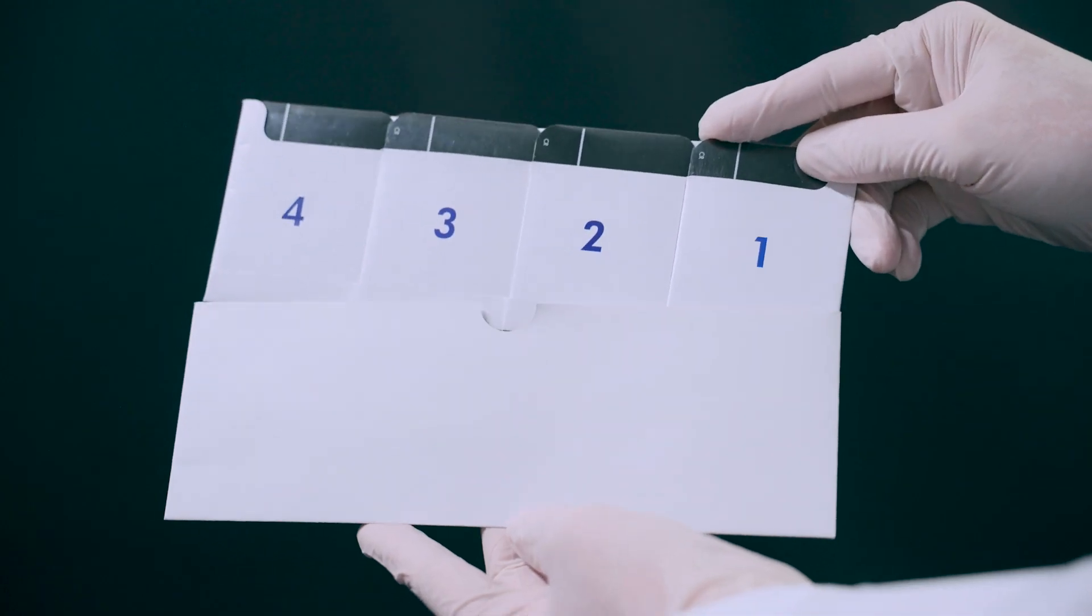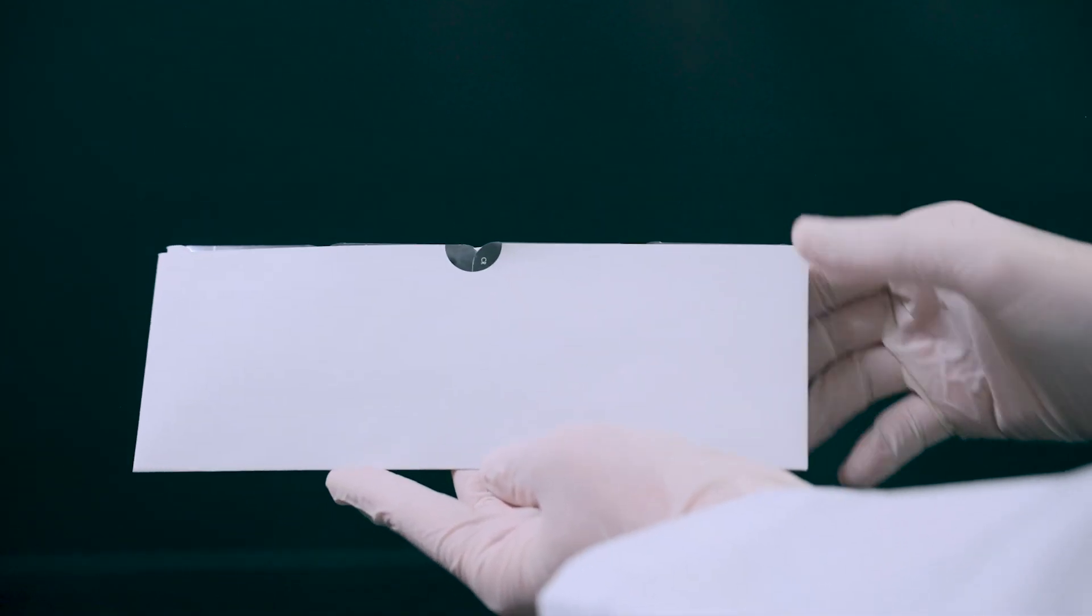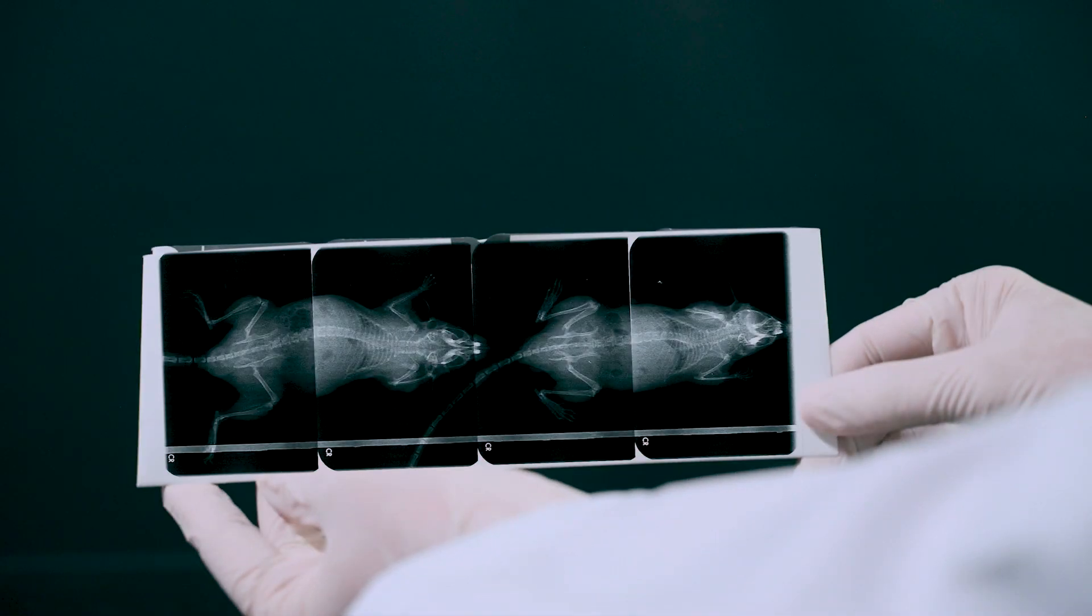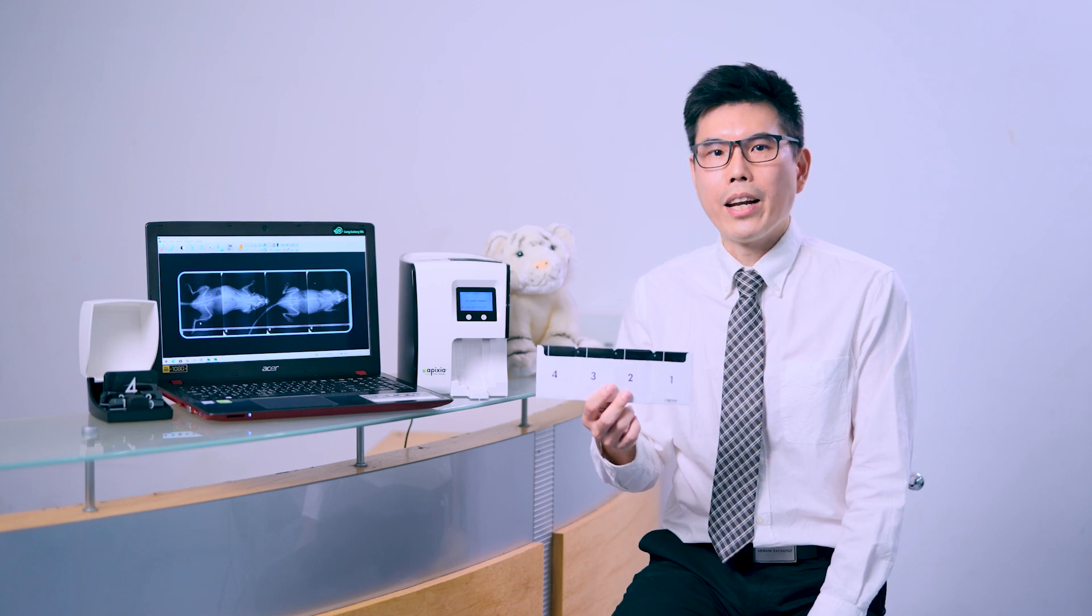We can position the plates in our pattern plate holder and take x-rays for exotic pets like turtles, mice, and snakes. After the x-ray, just simply scan each plate individually and our software will stitch the complete image automatically.